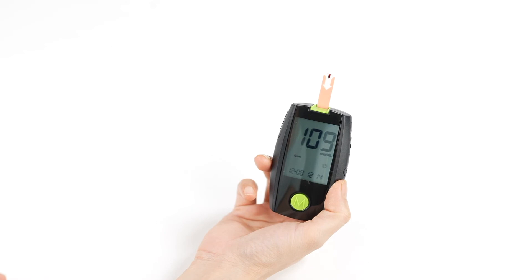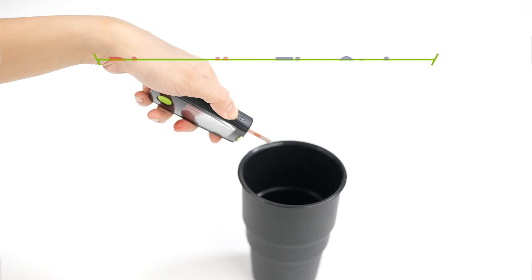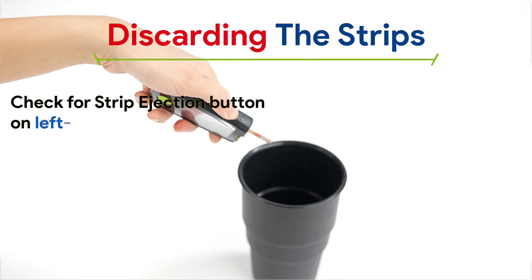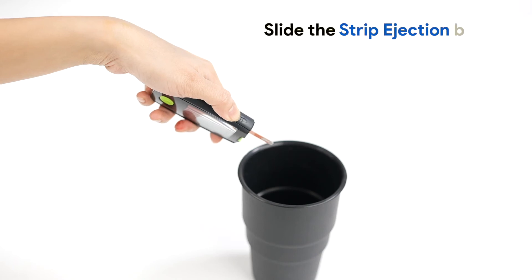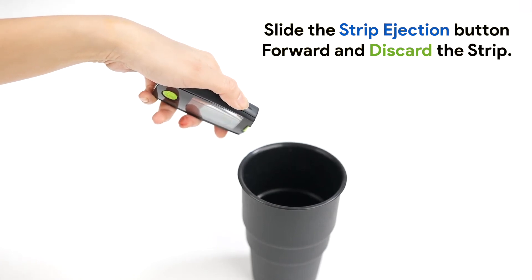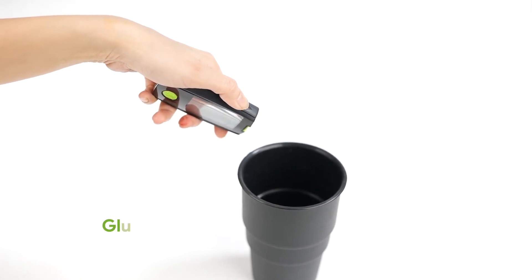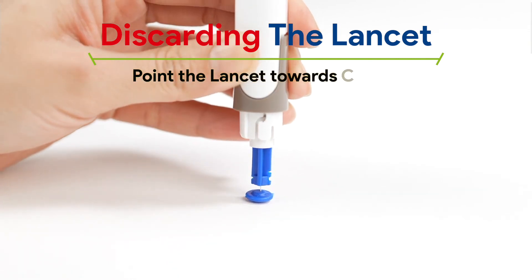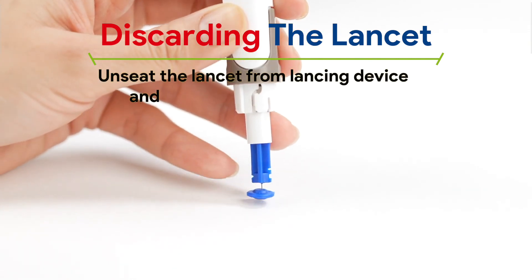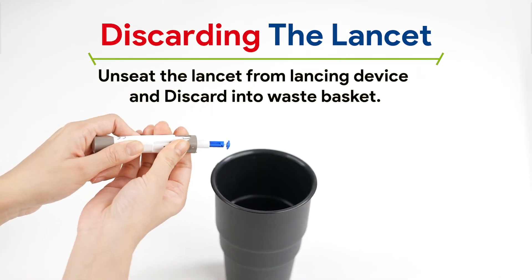Once the test is over, be sure to discard the test strip and used lancet. To discard the strip, check for the strip ejection button on the left-hand side of the glucometer. After completing a test, point the glucometer towards the waste paper basket, slide the strip ejection button forward, and discard the strip. The glucometer will turn off automatically. To discard the lancet, point the lancet towards the cap, unseat the lancet from the lancing device, and discard it into the waste basket.